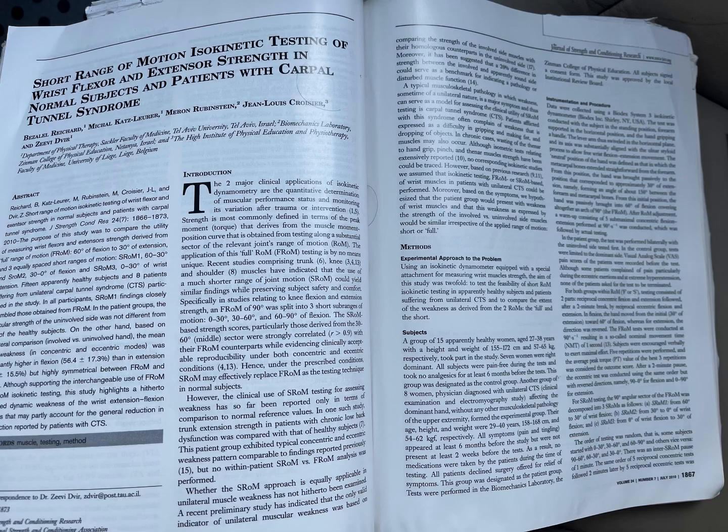For both groups within RoM, F or S, testing consisted of 2 parts, reciprocal concentric flexion and extension, followed after a 2-minute break by a reciprocal eccentric flexion and extension. In flexion, the hand moved from the initial 30 degrees of extension towards 60 of flexion, whereas in extension the direction was reversed. The FRoM tests were conducted at 90 degrees a second, resulting in the so-called nominal movement time, NMT, of 1 second.